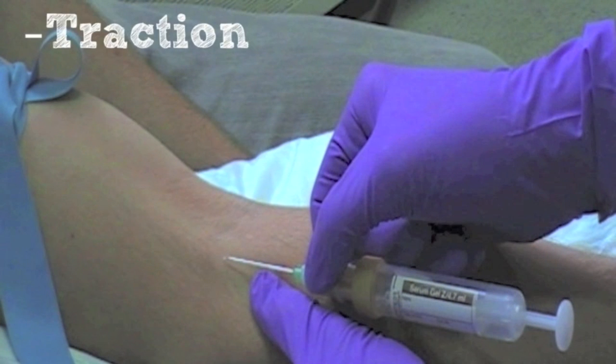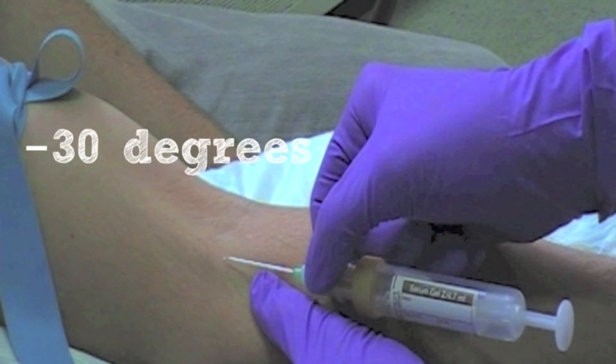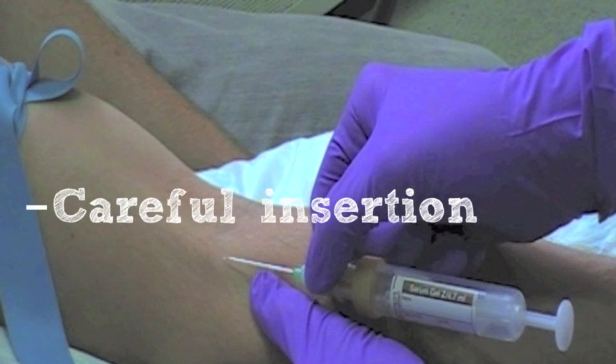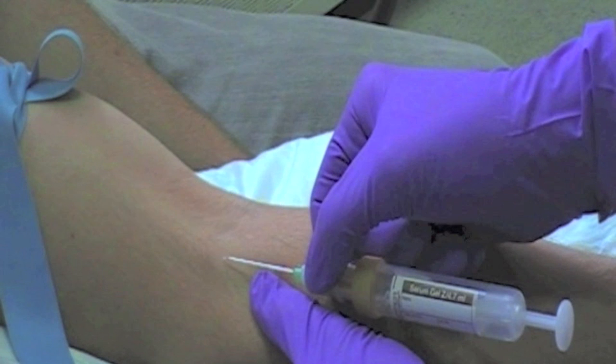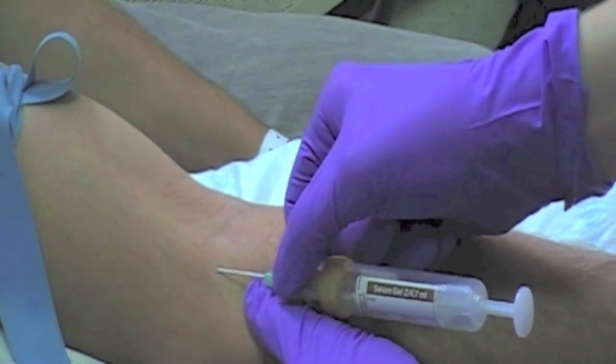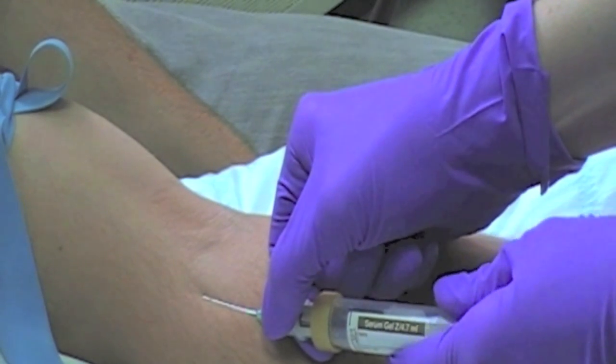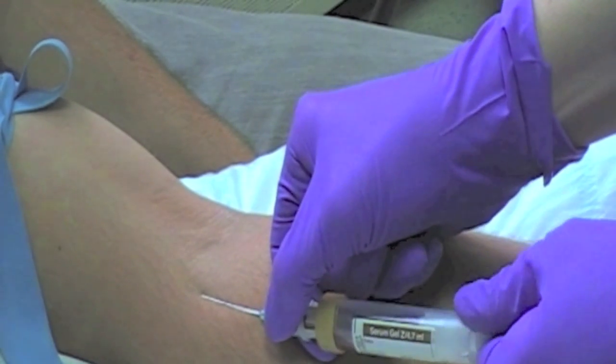Apply traction below and to the side of the proposed puncture site to help immobilise the vein. Advance the needle, bevel up, into the vein at an angle of approximately 30 degrees. Care should be taken not to insert the needle so far that it continues through the vein and out the other side. Once the needle has punctured the vein, you can release the traction on the patient's arm. You must not let go of the needle hub at any point, holding it securely between your thumb and index finger.